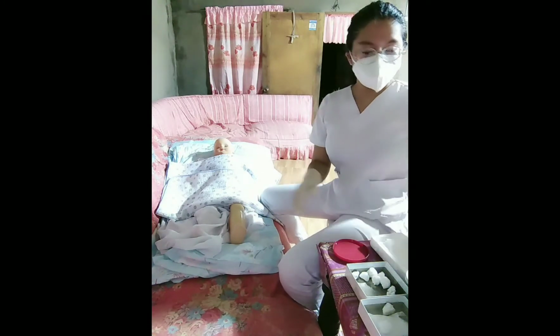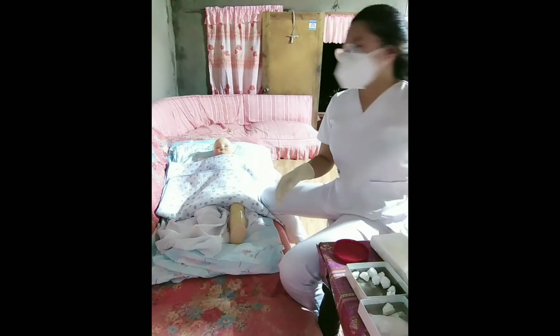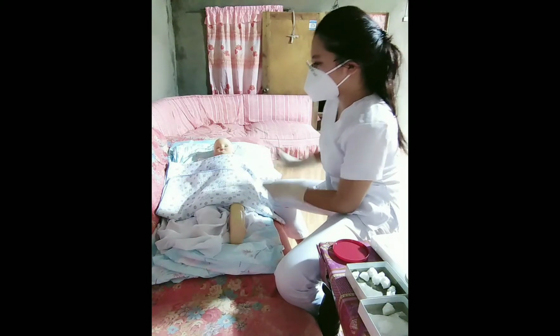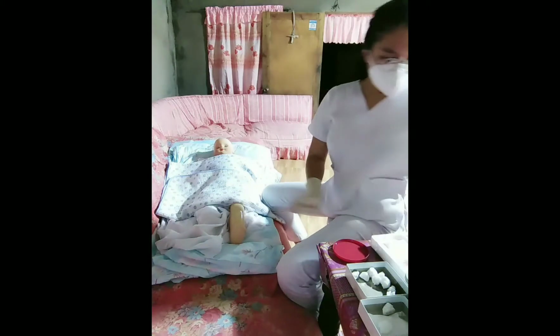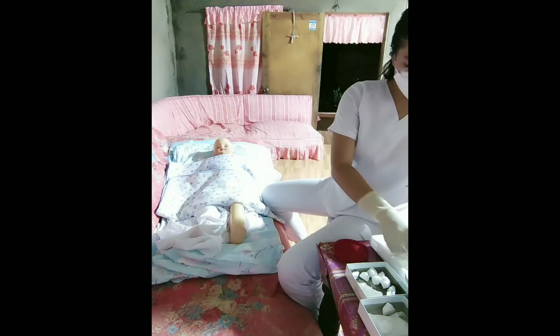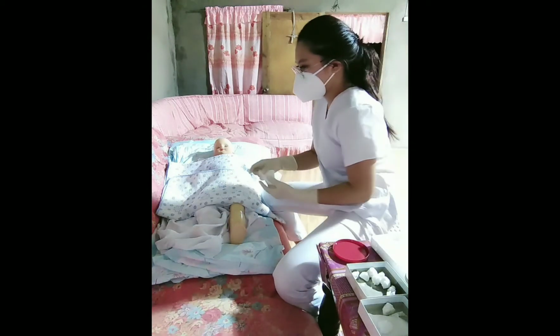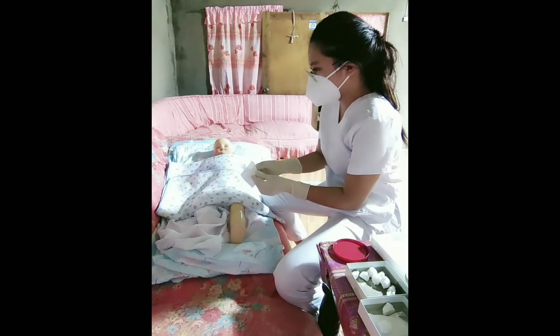The next step is to apply loose woven gauze as a contact layer and 4x4 gauze flat to fit around the drain if present.